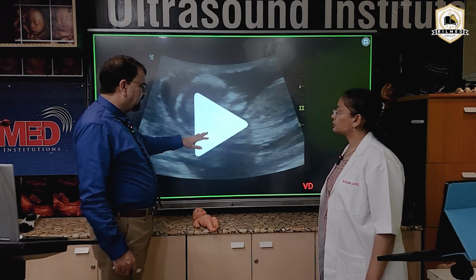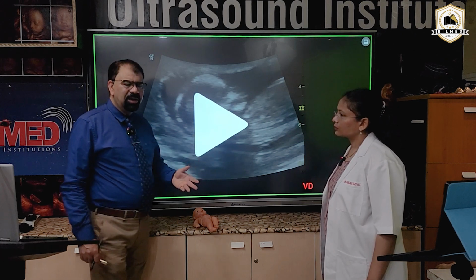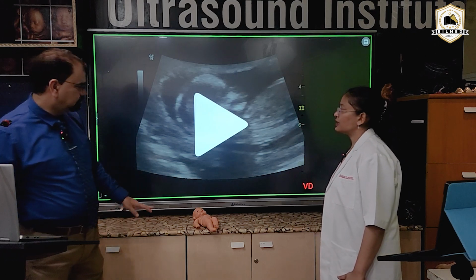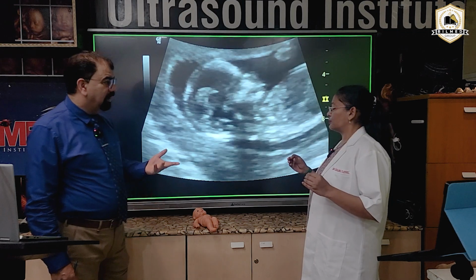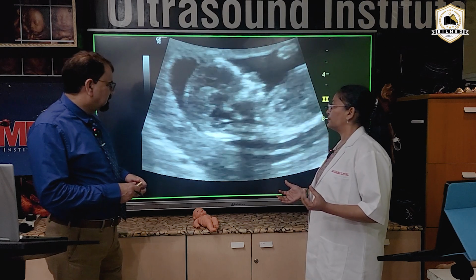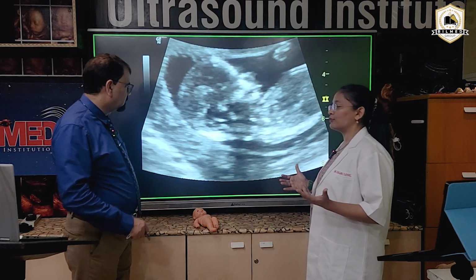Now, ICT, intracranial translucency. What actually is this intracranial translucency? It is basically the fourth ventricle. We try to see the fourth ventricle, and there are some supporting structures also which we have to see.